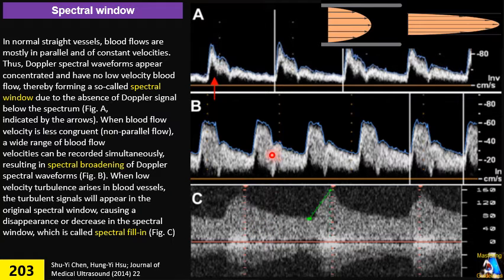The difference between the turbulent blood flow pattern and severe stenosis is that in the turbulence pattern, not only does the spectral window disappear, we will have some negative Doppler at that level too. So besides the increased acceleration time on the post-stenotic, the most important characteristic is that we will see negative Doppler on our envelope.